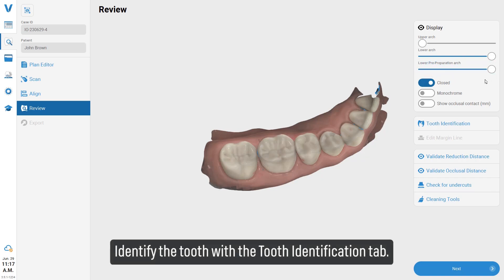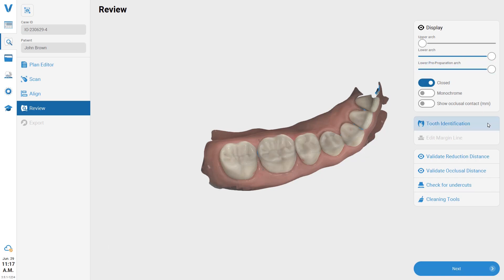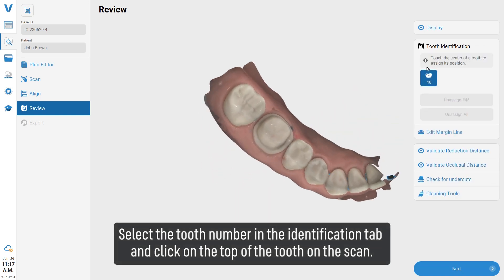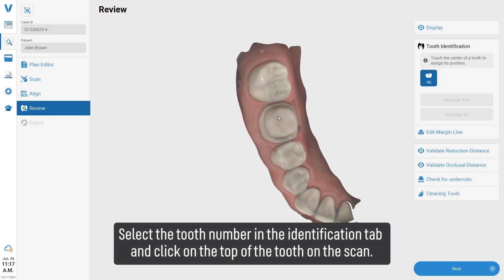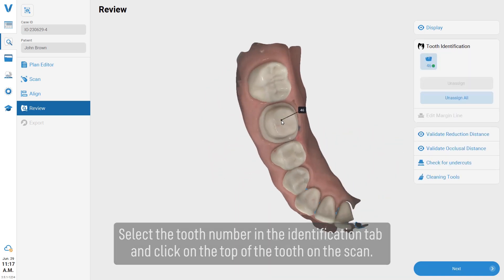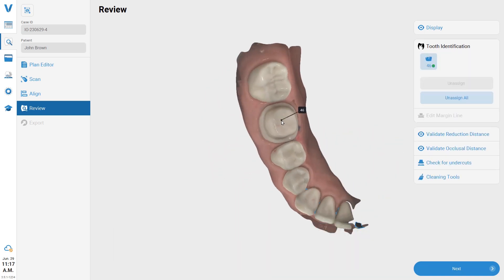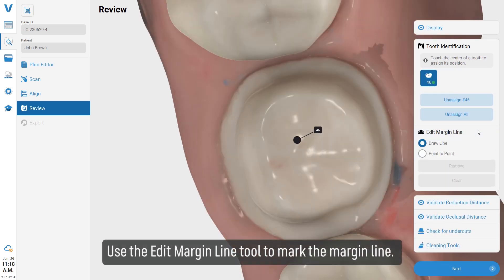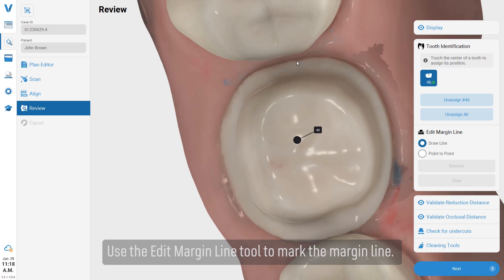Identify the tooth using the tooth identification tab. Select the tooth number in the identification tab and click on the top of the tooth on the scan. Use the edit margin line tool to mark the margin line.